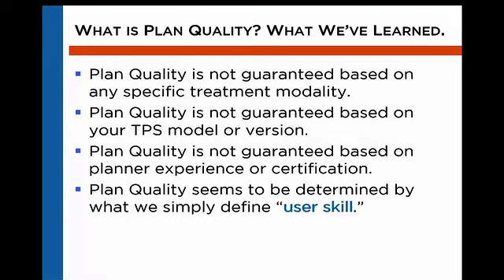So what we've learned through all these years is that plan quality is not necessarily guaranteed based on any specific treatment planning system or delivery modality. It's not based on one version versus another. It's not even guaranteed based on the experience of the planner or the certification level. We ran correlation studies, and a lot of those things didn't seem to statistically correlate. What we do find, though, is that there is a large amount of user skill that goes into determining it. How well can a certain user with a certain planning system generate a plan? That's what we're trying to learn, and then we're trying to spread that information.